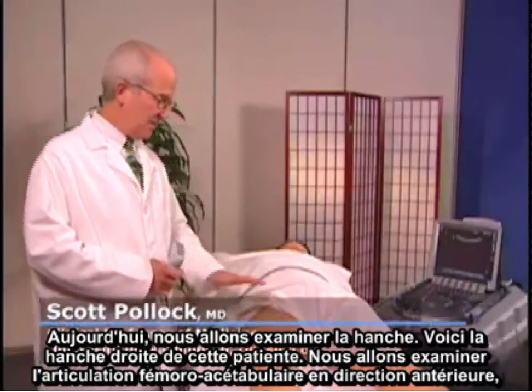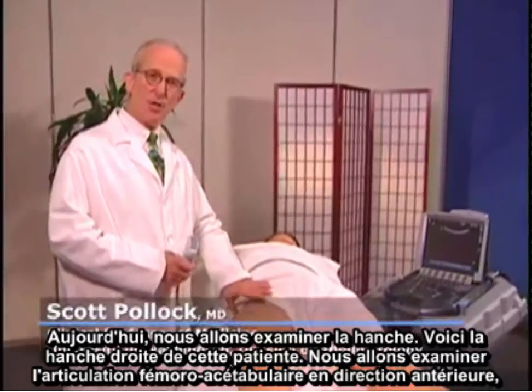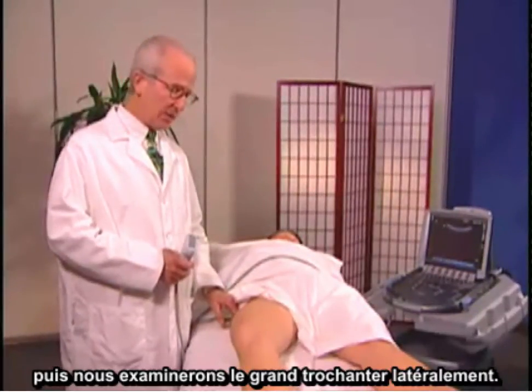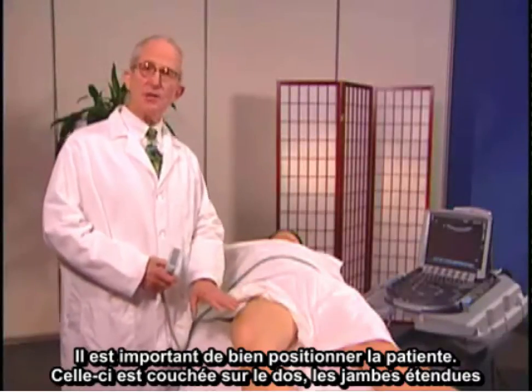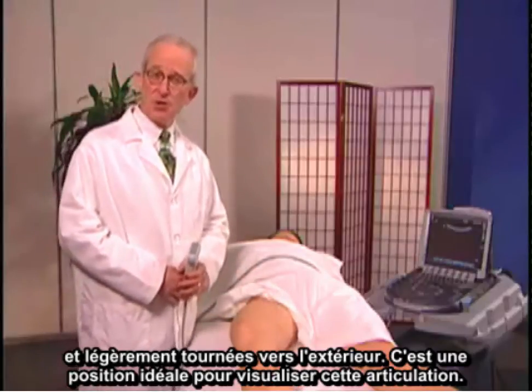We're going to examine the hip today. This is her right hip, and we'll look anteriorly at the femoral acetabular joint, and then we'll also look laterally at the greater trochanter. Positioning is important. She's lying on her back with her leg extended and slightly externally rotated. This is the best position to see this joint.